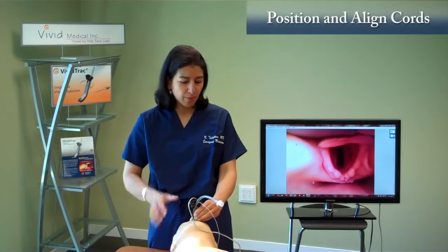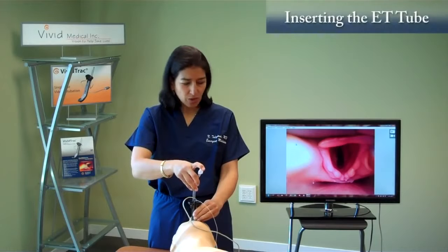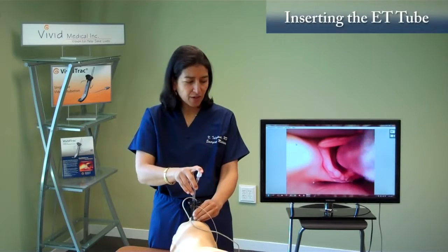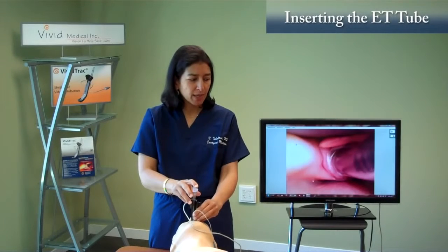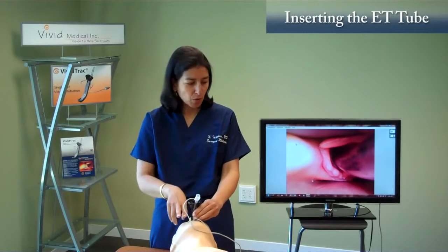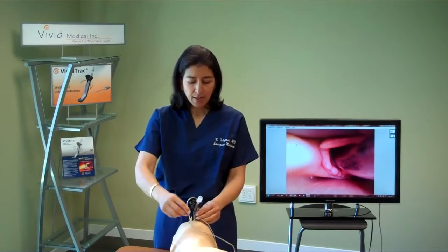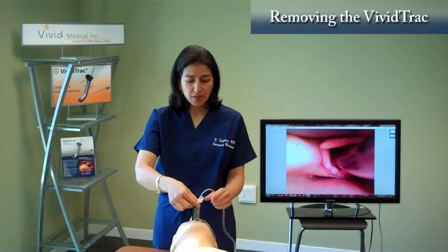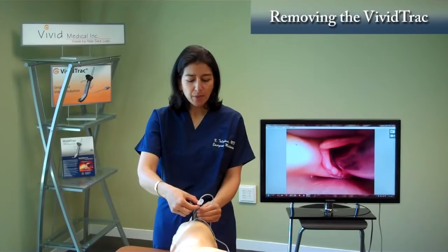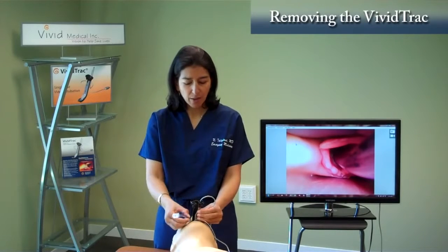Once you have it in the right position where you see the triangle of your airway, you just take the top of the ET tube and very gently push it in, and it'll go directly into the trachea. As soon as you see the balloon go through the cords, you can blow up your balloon, and then to release the ET tube from the device, you hold it at the top, very gently push it forward, and pull it out to the side of the mouth.